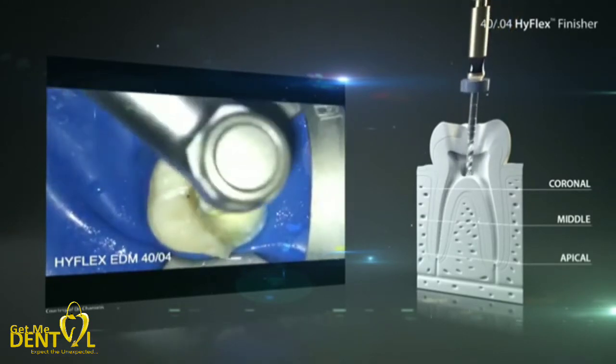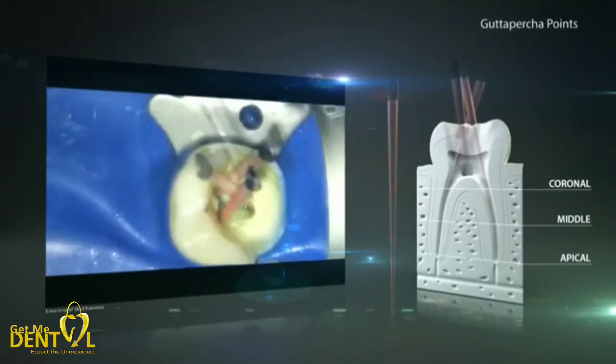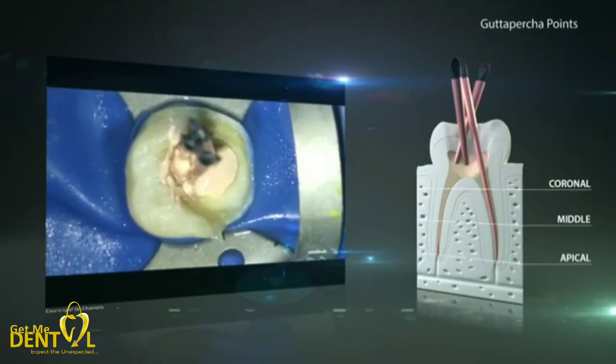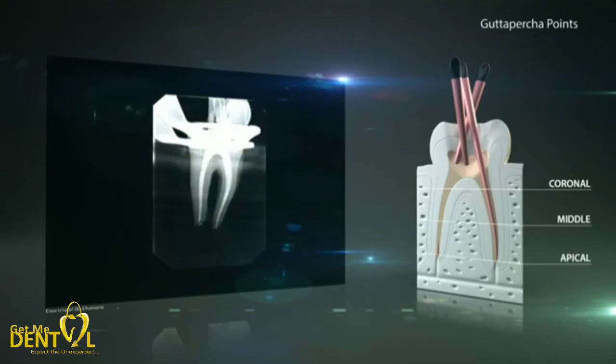After the preparation and the thorough rinsing and drying of the canal, it has to be sealed permanently to prevent ingress of bacteria. With perfectly matching gutta-percha points and gutta-flow bio-seal, an optimum seal of the root canal can be achieved. The additional bioactive property of the gutta-flow bio-seal regards the formation of hydroxylapatite crystals on the surface after curing, when the material comes in contact with body fluids, which can additionally support healing.